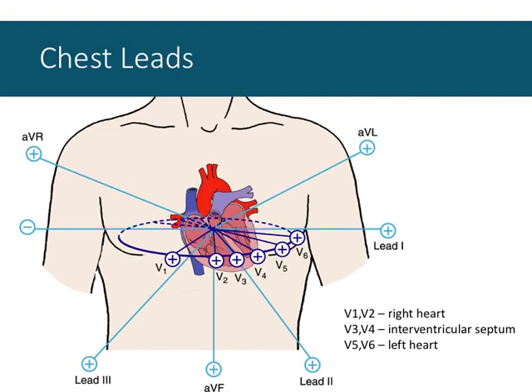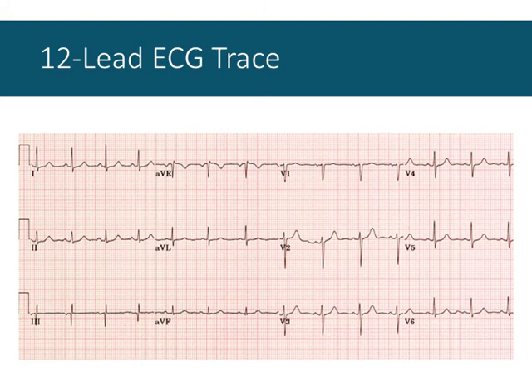So very detailed, as you can see here. This is the information we get from a 12-lead ECG. Normally, we're used to looking at all the way on the left, the middle line, the first quarter of that line. That's the lead 2 ECG trace, with our P wave, QRS complex, T wave, and that's all we've known so far. Now we're adding lead 1, lead 3, all the augmented voltage leads, and then V1, 2, 3, 4, 5, 6. Very detailed, complicated view.